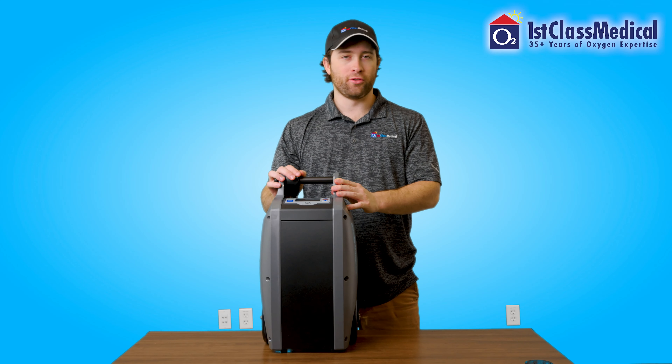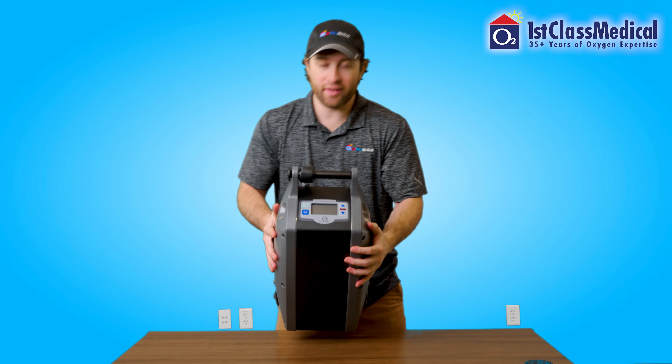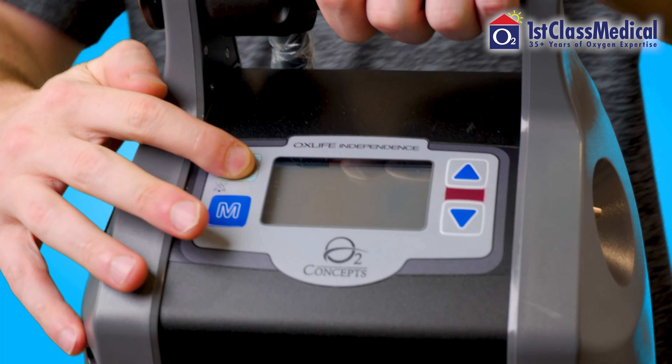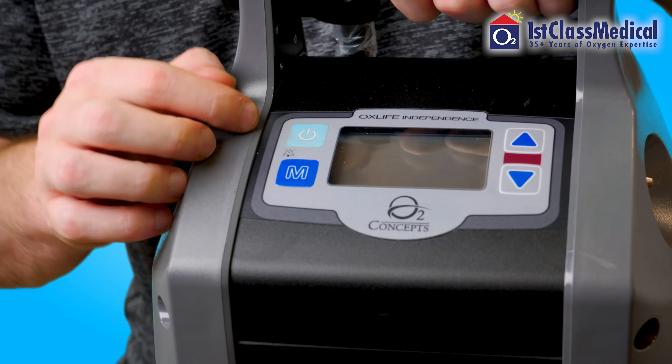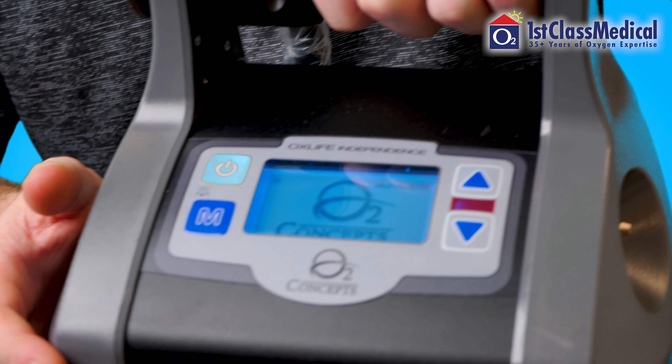To power on the O2 Concepts OxLife Independence, you're going to see a little green button on the top. This green button is the power button — just hold that for a couple seconds. You're going to see the screen flash a little bit, and eventually you'll see the logo and the manufacturer's name on there as well.